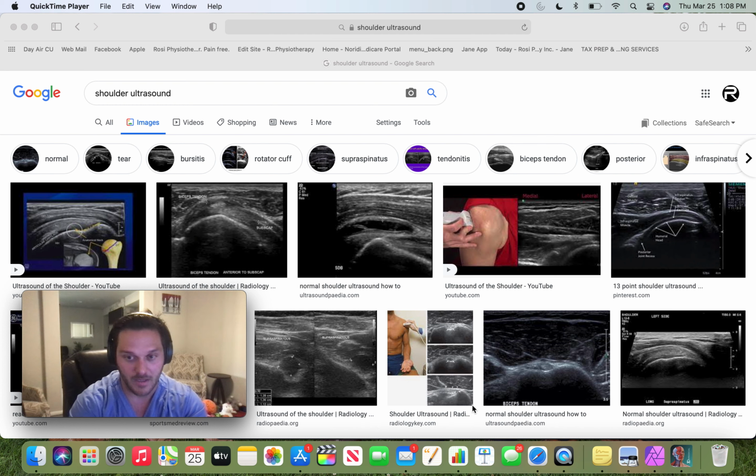And so a patient comes in, they have non-specific shoulder pain, and so you do an exam. Some of the images that I have here up on the screen are of shoulder images. Now, I would not expect anyone here to be able to identify what exactly is being seen, because if you are not trained in it, this is not as easy as reading an MRI or a CT scan, which is really quite simple to read.